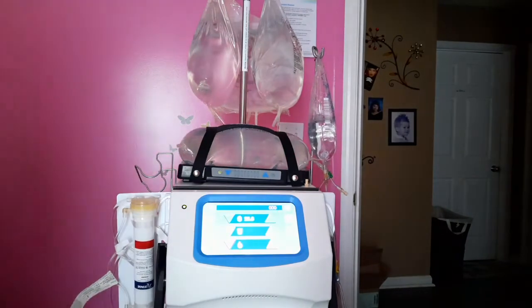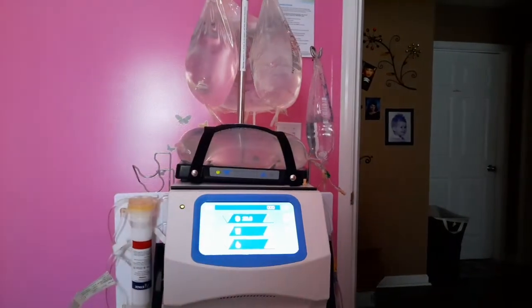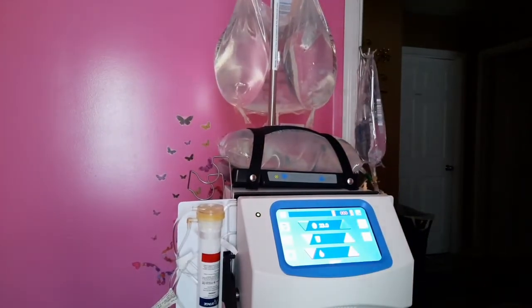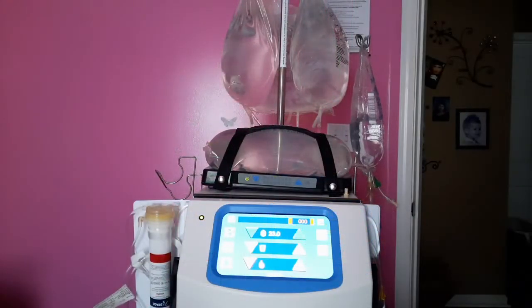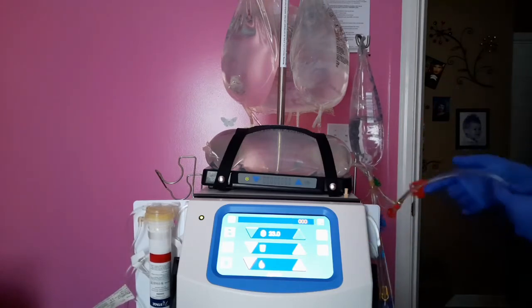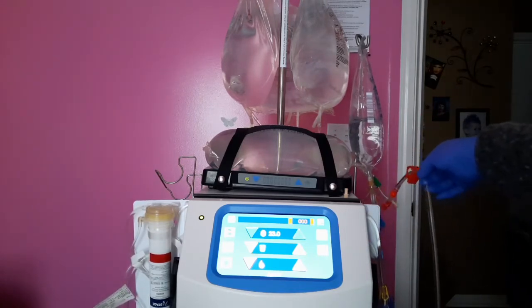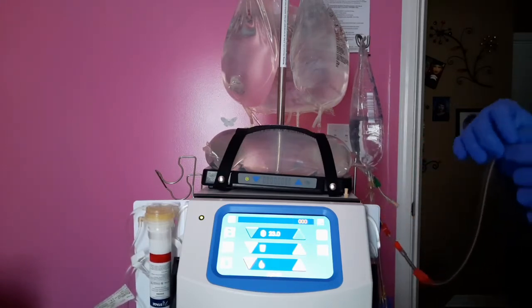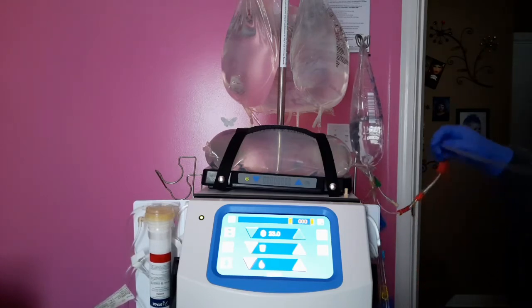Okay, so now we are going to do the snap and tap. Let me get by. We're going to snap and tap the lines. We're going to snap the lines and tap the pressure access pressure pod and the dialyzer. And that's to get any excess air that might still be in the lines out, just for security purposes. Here's the red line. The red line is your arterial line. That's the bottom needle. This is the line that's responsible for the blood taken out of your body to travel.